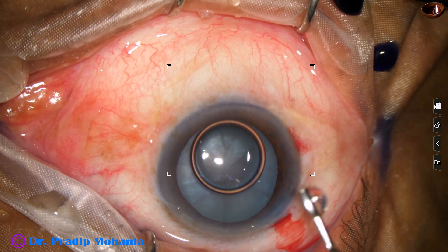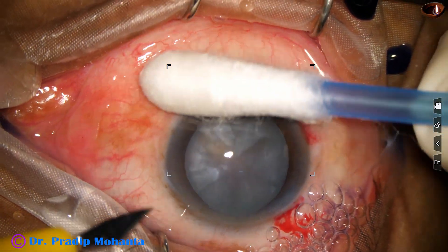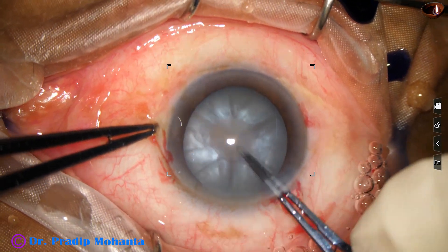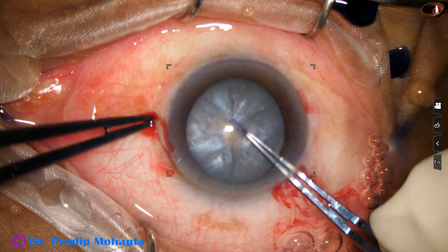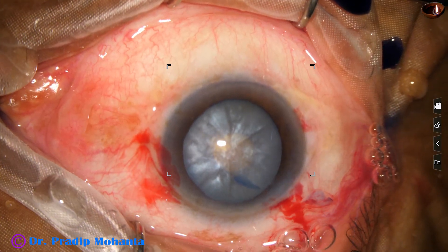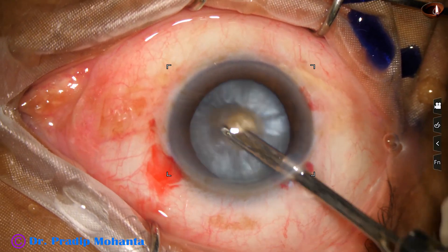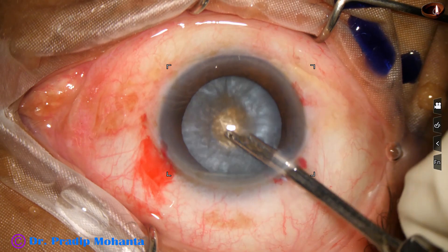After making the incisions, the anterior capsule has been stained with trypan blue dye. Now the anterior chamber is filled with 2% hydroxypropyl methyl cellulose. I do not use any high-cost viscoelastic substance. In India, HPMC — that is hydroxypropyl methyl cellulose — is very economical, and surgery cost can be reduced quite a bit. Most cases, say 99% of surgeries, can be managed with HPMC, though some situations require a combination of chondroitin sulfate and sodium hyaluronate.